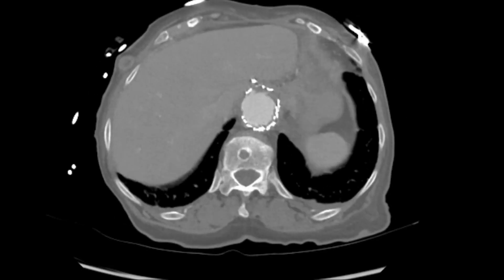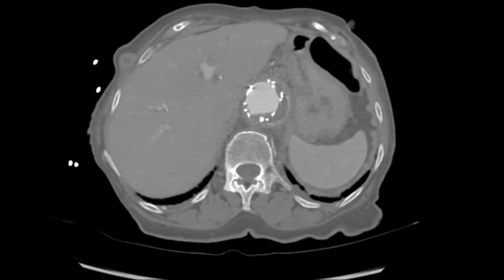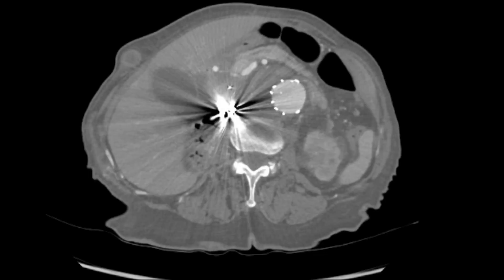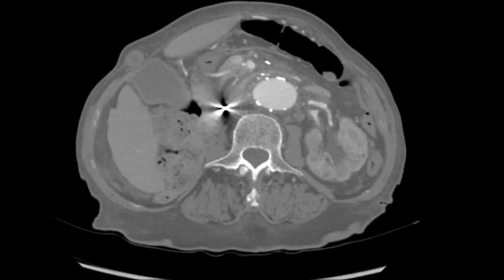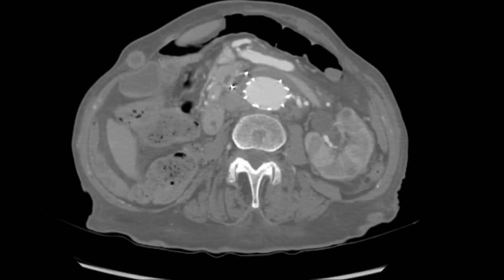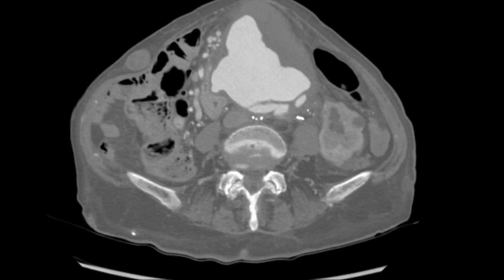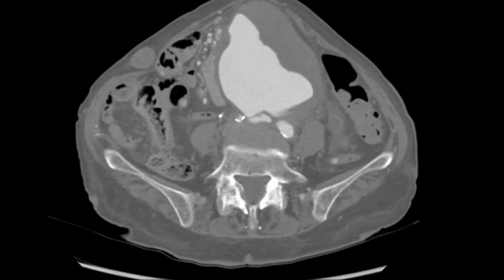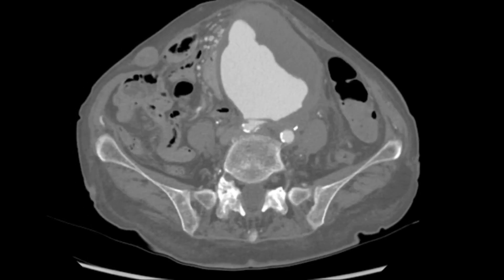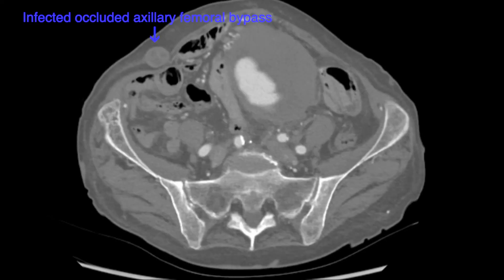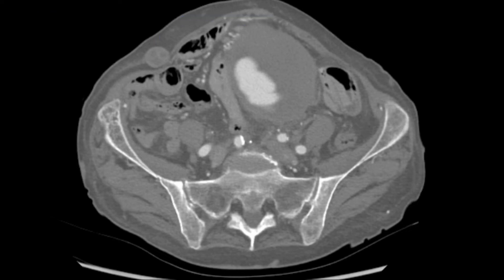On her current admission, she presented with abdominal and severe back pain. A CT chest, abdomen, and pelvis performed showed a contained rupture measuring roughly 10 cm in size, as shown on this CT scan. This was thought to be related to suture line dehiscence of the aortobiiliac bypass graft. Also visualized on this CT scan was an occluded, infected axillary femoral bypass.